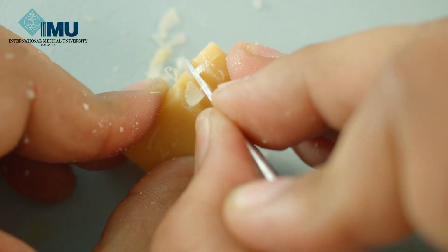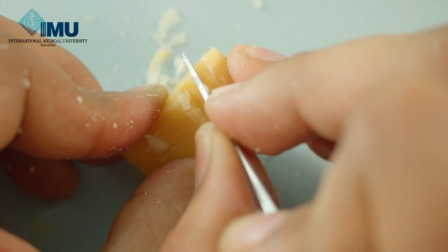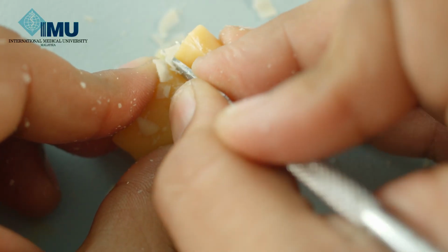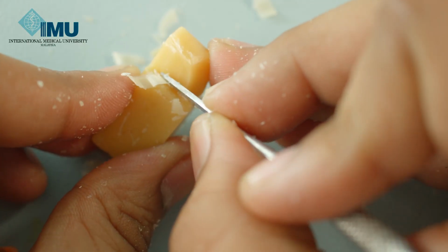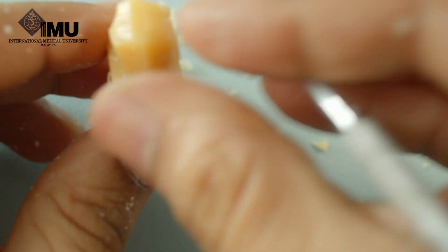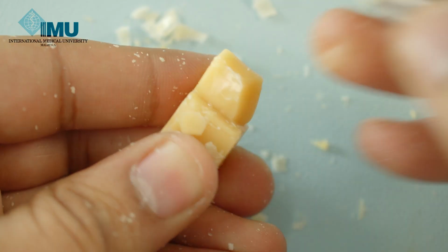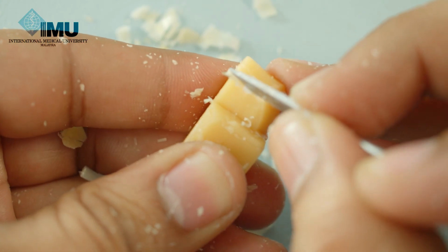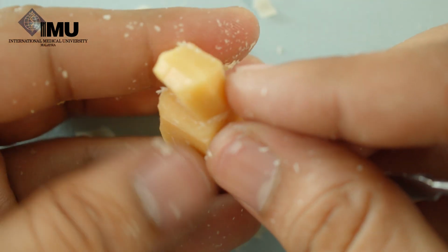Make the lingual side narrow layer by layer. Similarly on the other side.